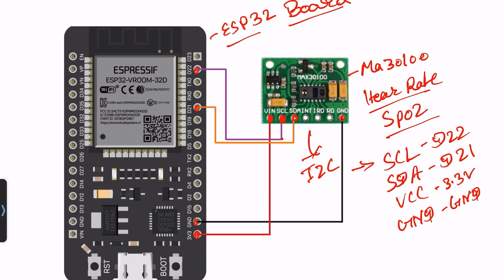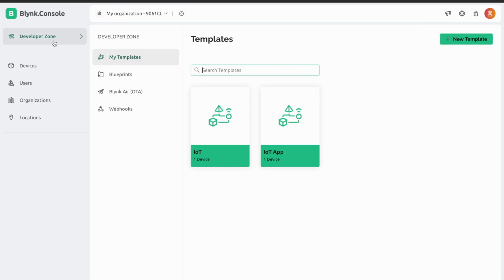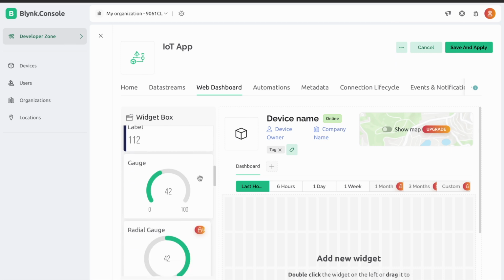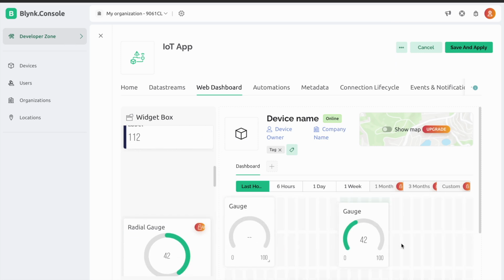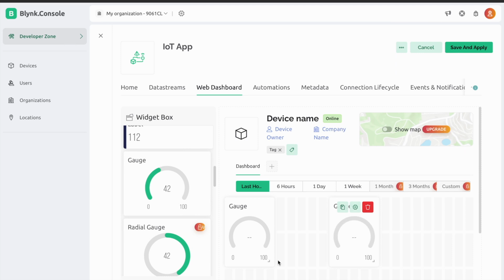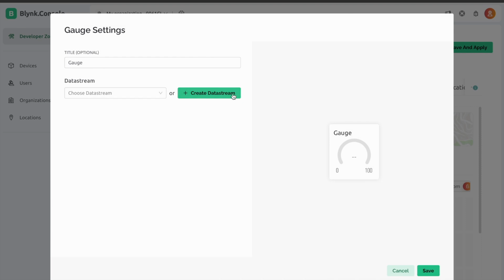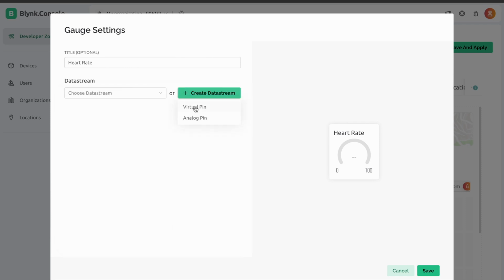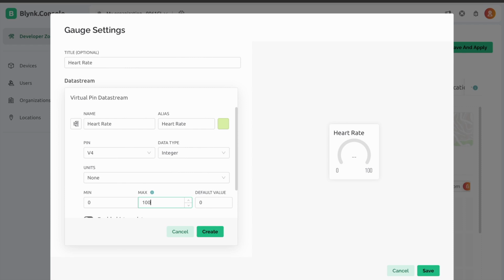Okay, setup of the Blynk app. Now log in to the Blynk app, create the developer zone and go to the web dashboard. I'm measuring two data, that's why I choose 2 gauges. Go to settings, edit this gauge name to heart rate. Go to create data stream, choose virtual pin and set the maximum value to 200, 0 to 200.